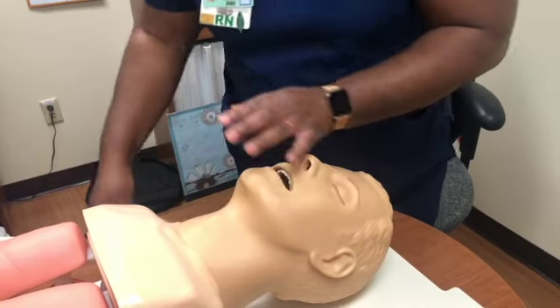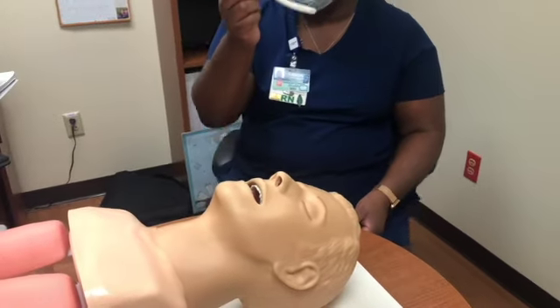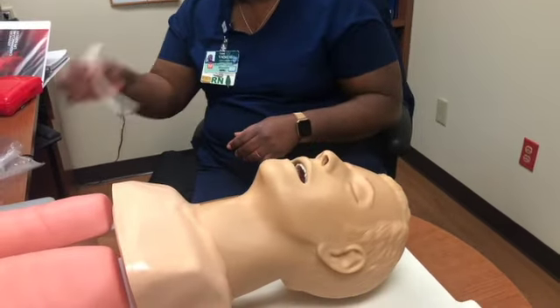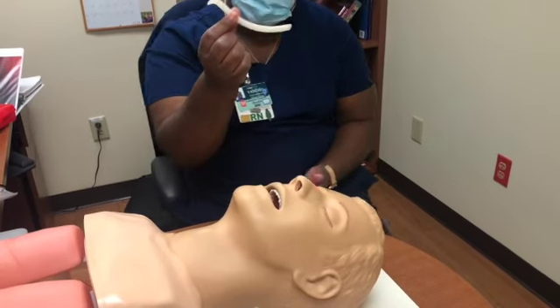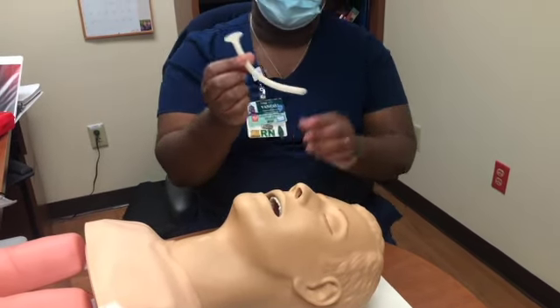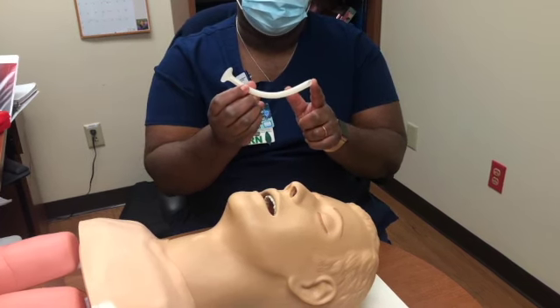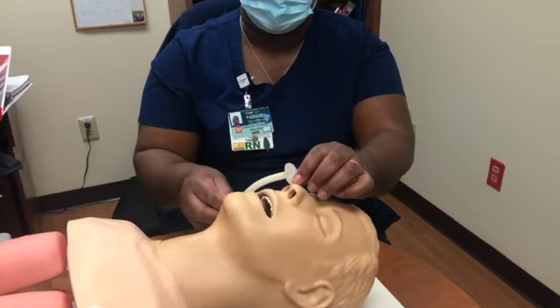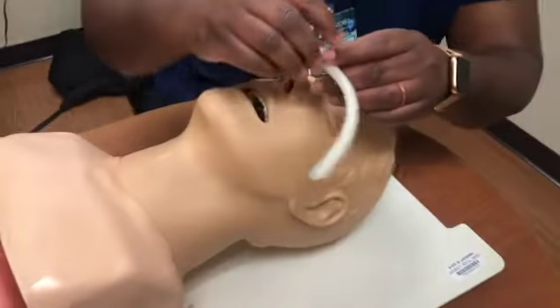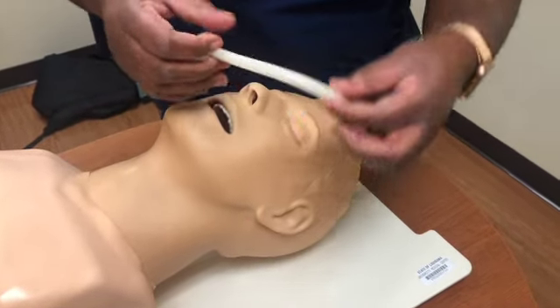Then we have the nasopharyngeal airway. Again, the nasopharyngeal airway can be used on patients who are conscious or semi-conscious. You do have to lubricate the tip with water-soluble gel. To measure it, you would measure from the tip of the nose to the earlobe. Tip of the nose to the end of the earlobe.